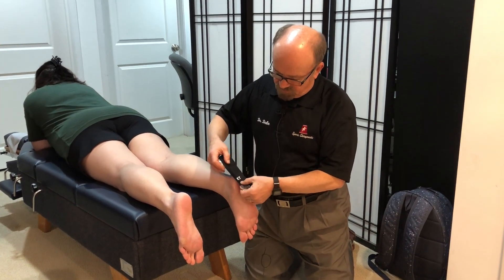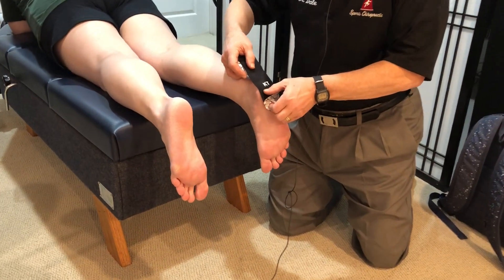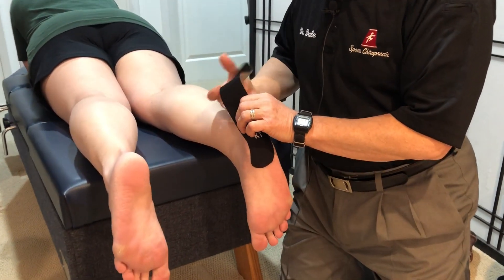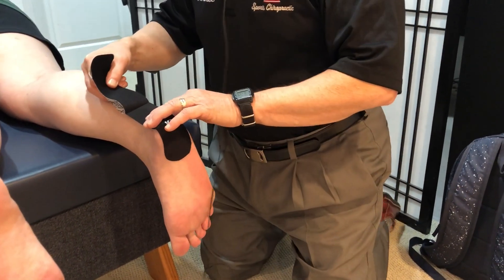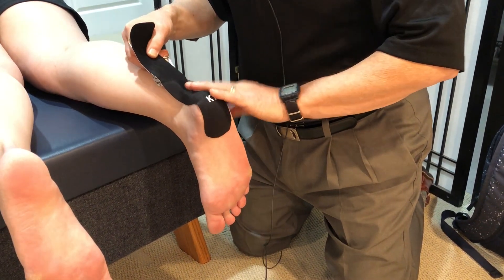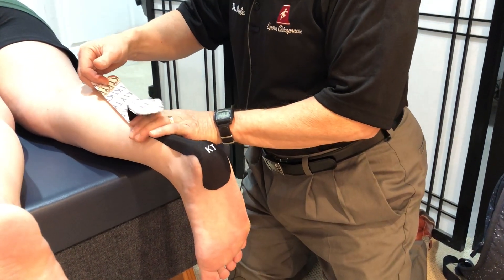We apply it to the calcaneus, round the edges of the tape, place it on the calcaneus. Here's where it gets a little bit tricky as we're going over the Achilles tendon — a little bit of stretch is required, and we lay it down on both sides. Avoid any wrinkling, and bring it up into the belly of the calf muscle.